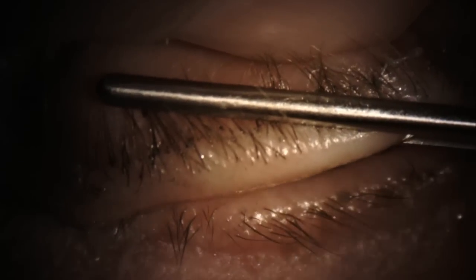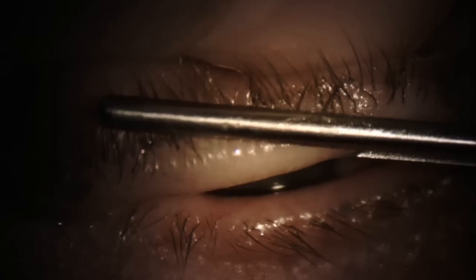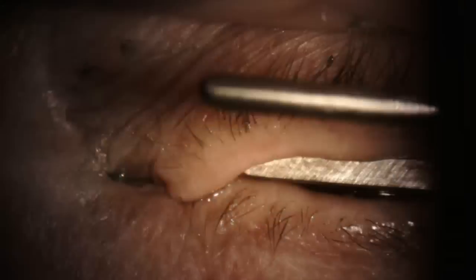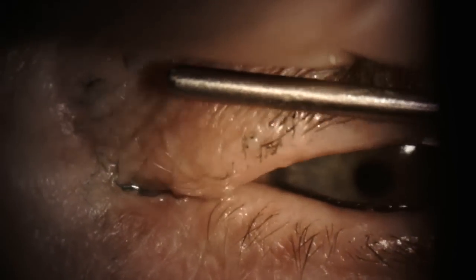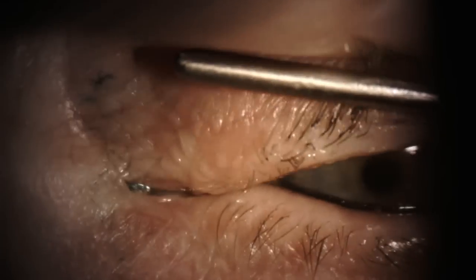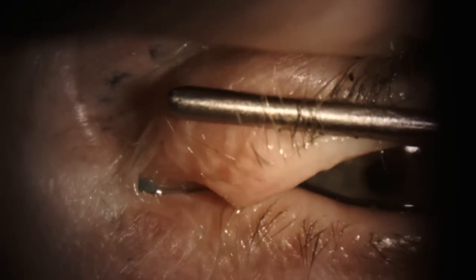Most of this is, as you can see, molten because of the targeted heat therapy from the TearCare eyelid devices. The central zone is being expressed, and now the nasal zone. This essentially completes the meibomian gland expression. So two cycles, lower lid, upper lid, fornix to margin.